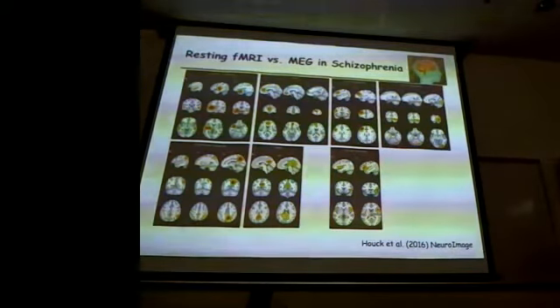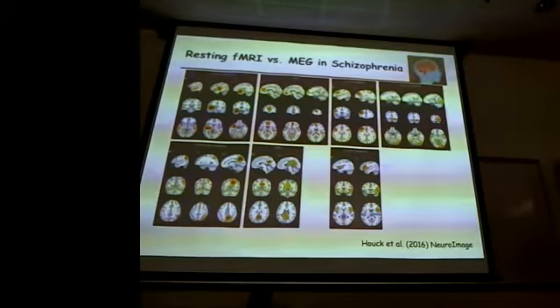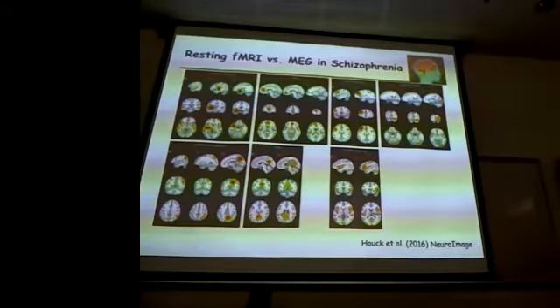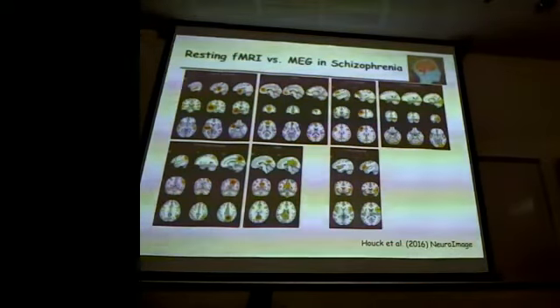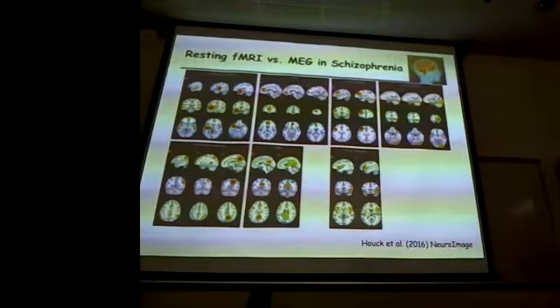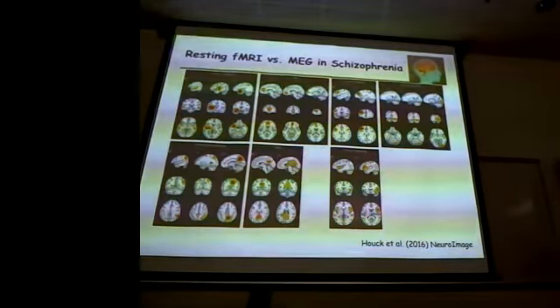And it's not the same problem as you have with fMRI versus MEG, because you at least have the same time scale. But the fact is that it's much harder to solve the inverse solution for MEG. You don't have a lot of the variables that you actually need, and there isn't a good way to really decide what the best one is.